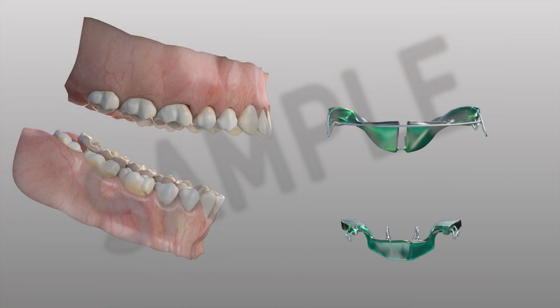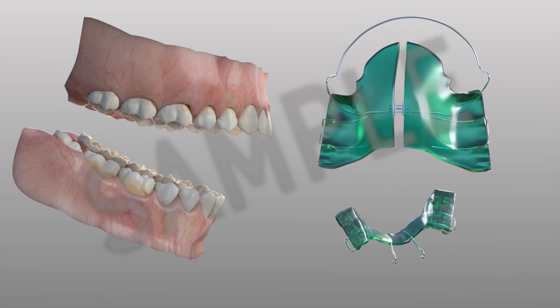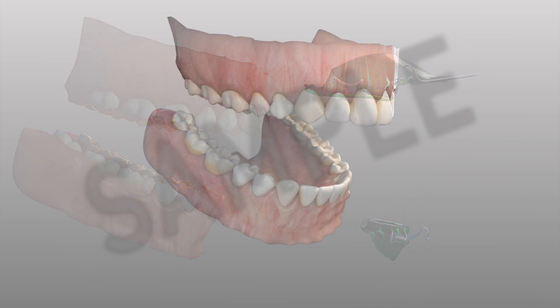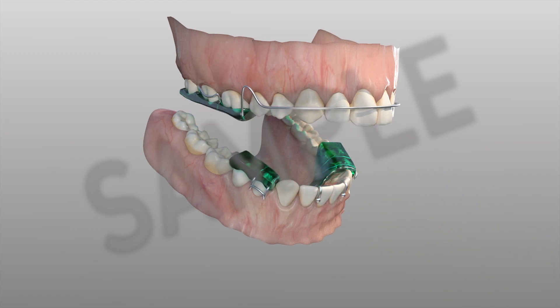A removable functional appliance is a specialized appliance used in orthodontics to improve jaw position and correct an overbite. The functional appliance is customized and designed to fit the needs of each patient. Once in place, the appliance will guide the lower teeth forward.